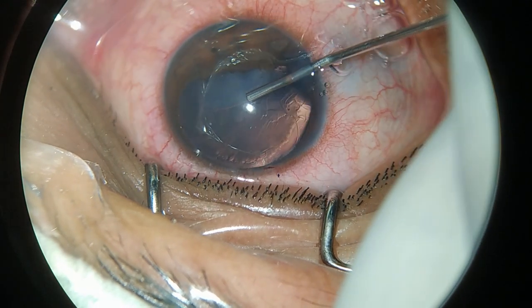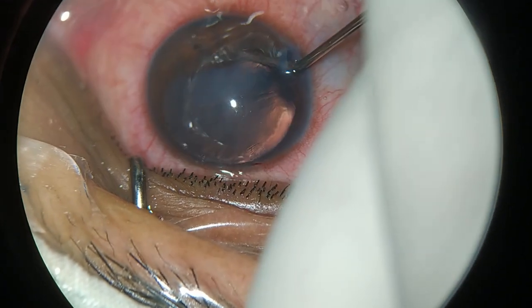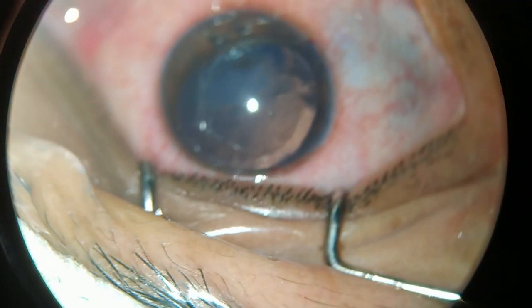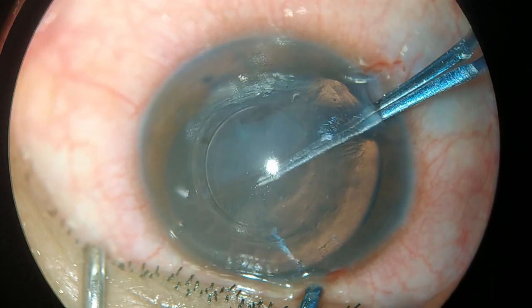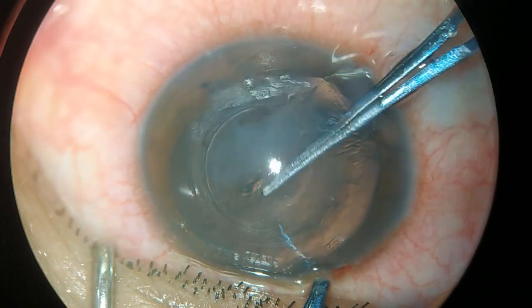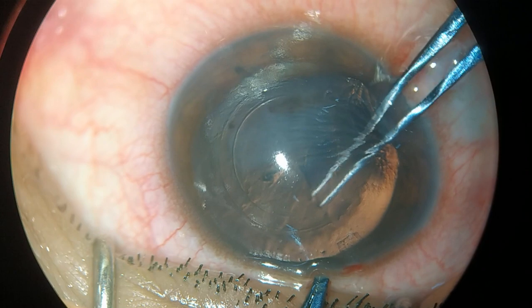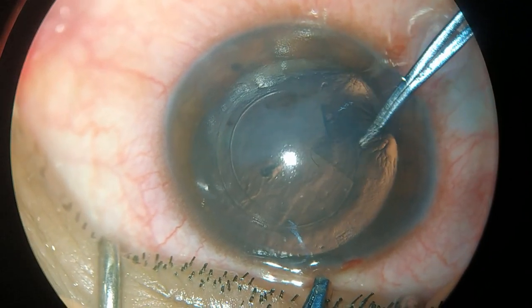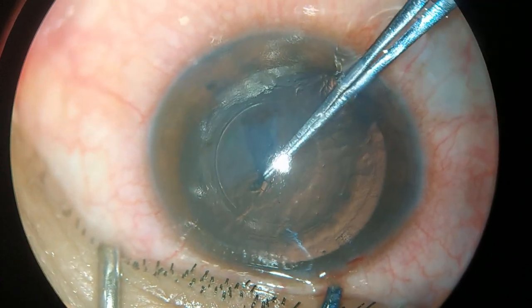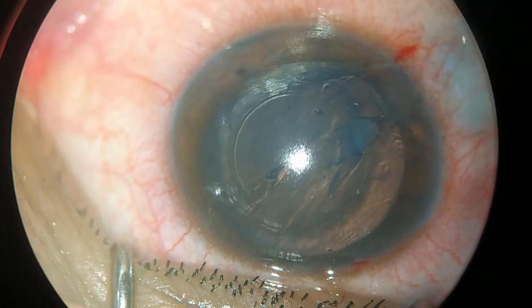As the AC is formed with visco, the posterior synechiae is released using the same visco cannula. Now is the time to face the first challenge in this case. The fibrotic anterior capsule at the inferior region extends almost till the anterior capsule periphery. This makes the completion of the rhexis difficult, but in this case we are able to tackle it by carefully going around the fibrotic region.